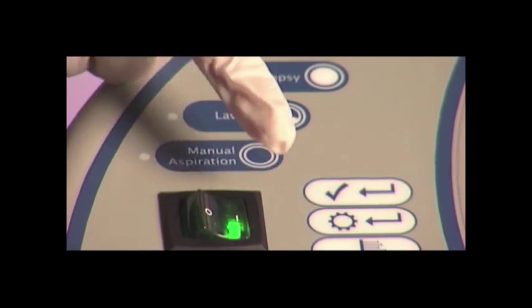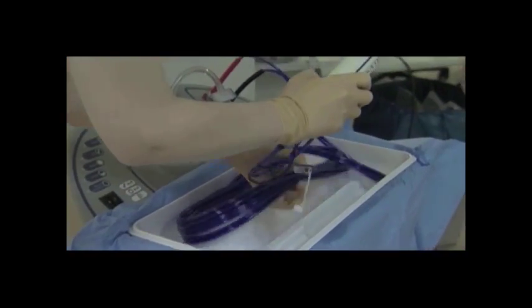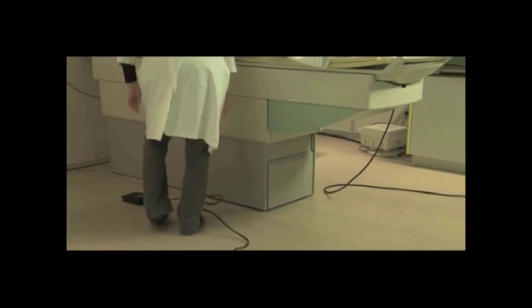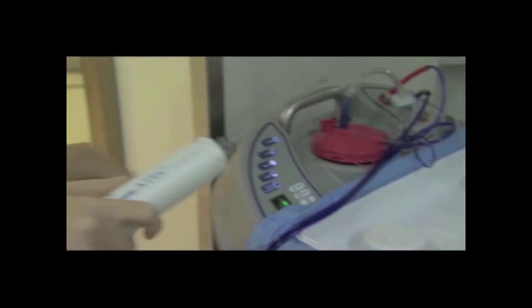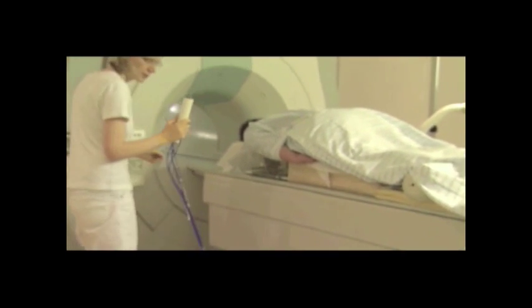Turn the Atec console on and take the MRI-compatible handpiece and foot switch into the MRI suite. The Atec MRI handpiece is equipped with 20-foot tubing to allow the physician to easily perform the biopsy while maintaining patient safety with the console located just outside of the MRI suite.